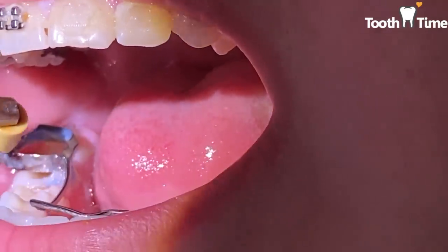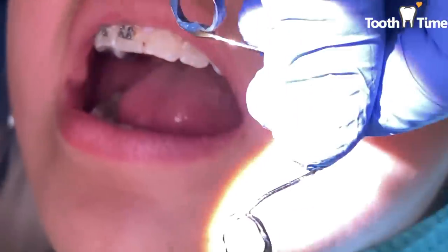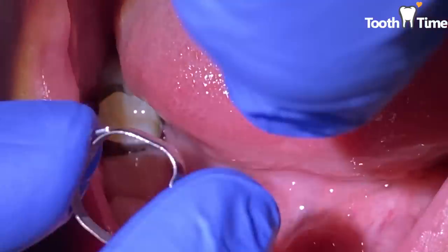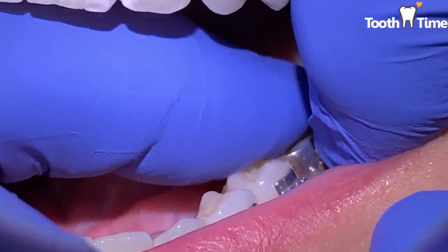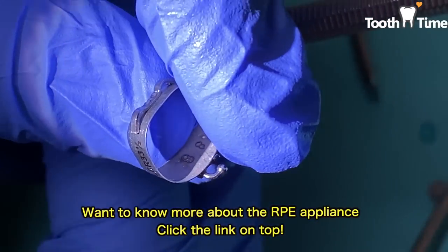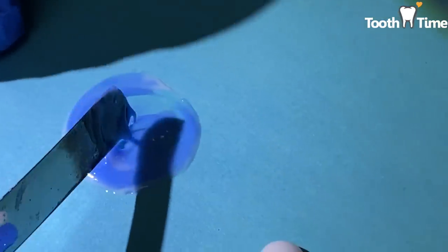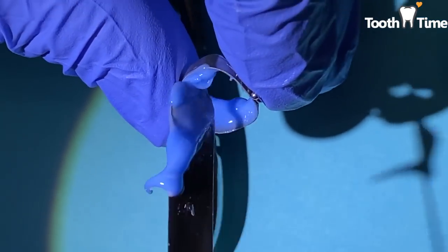This patient initially started with phase one treatment and has now transitioned to phase two. Phase one is when we start treatment early — usually when the patient is nine, ten, or eleven — they haven't had all their teeth erupted and their bite is different. We started with the phase one RPE expander appliance. A link will be above to show you what an RPE is. We then took off the RPE and put a lower lingual retaining arch, which retains the arch of the teeth while the RPE is removed to avoid any relapse.